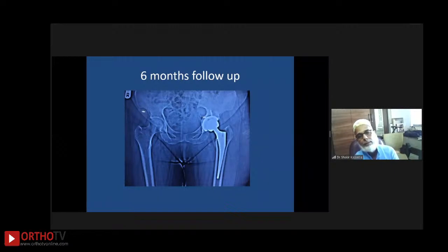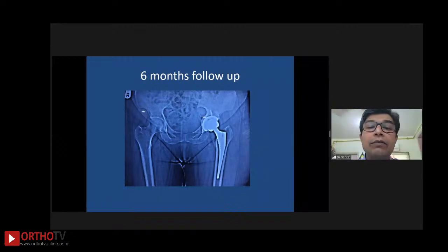Yeah, this is the 6-month follow-up x-ray of pelvis. Nice growth, and it shows good healing of the medial wall.